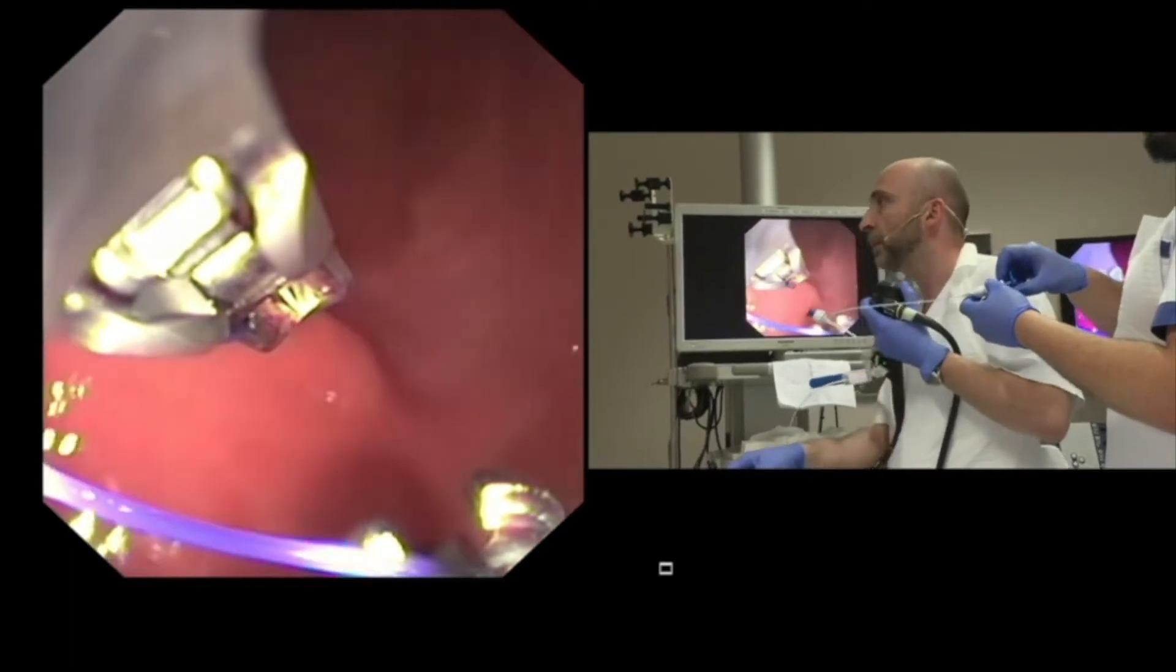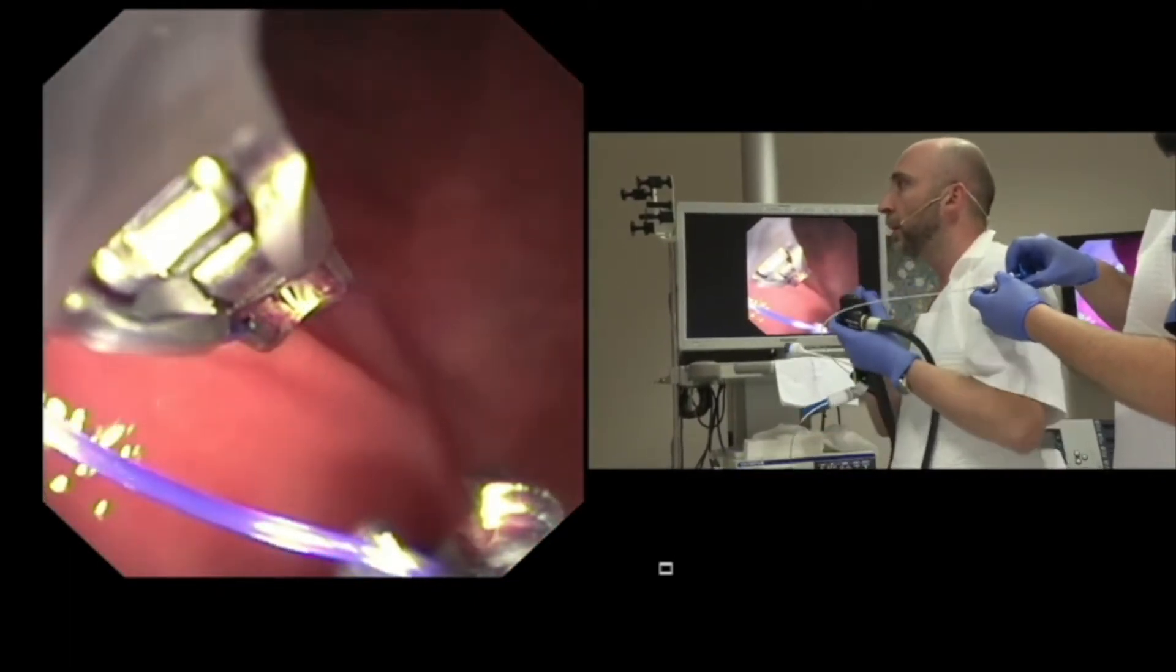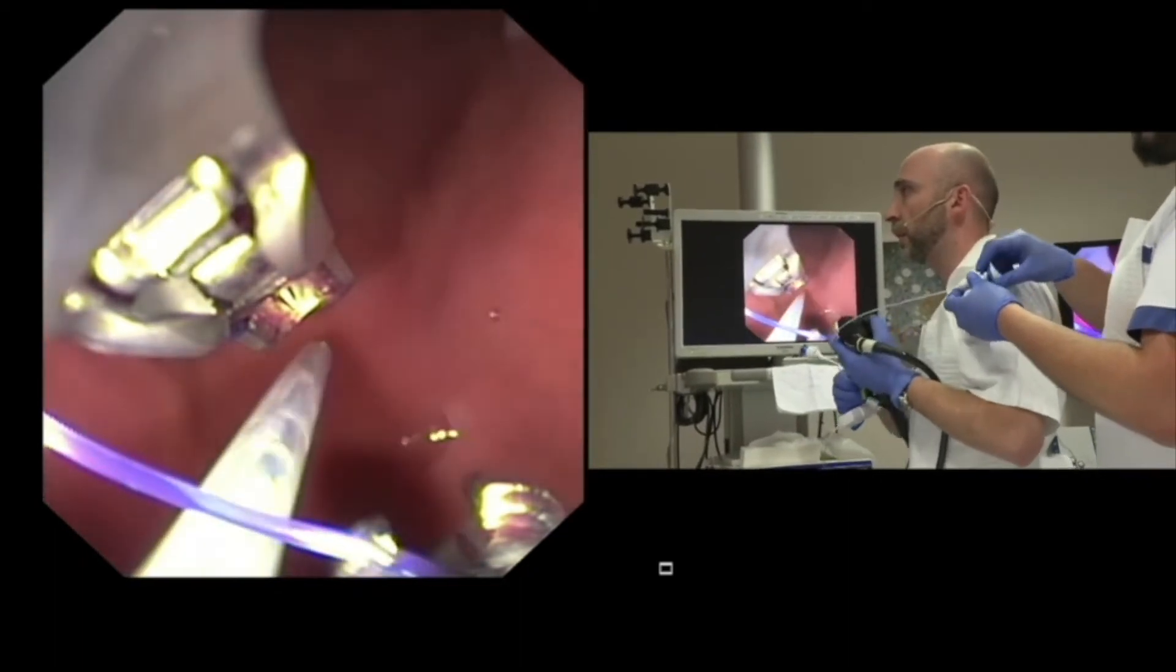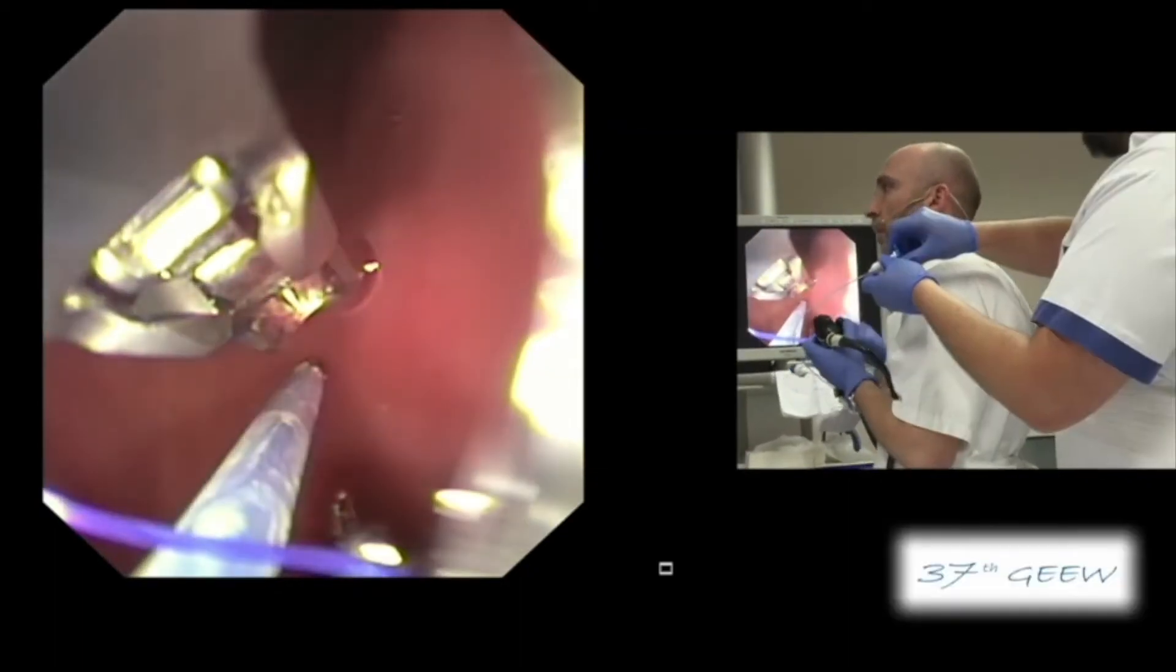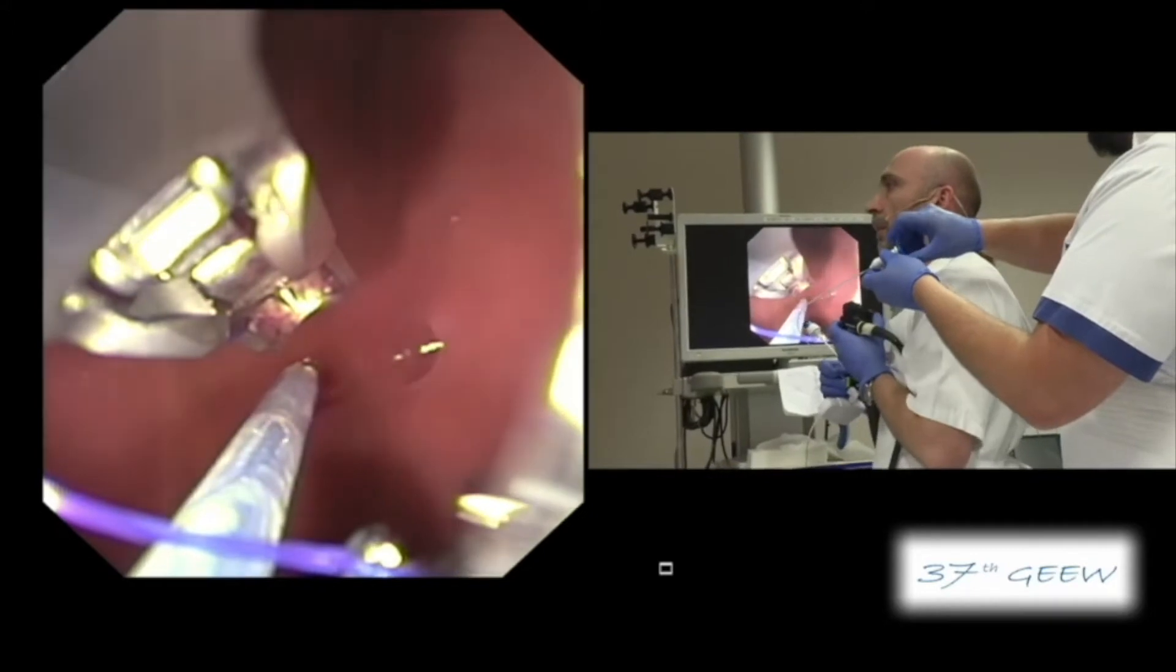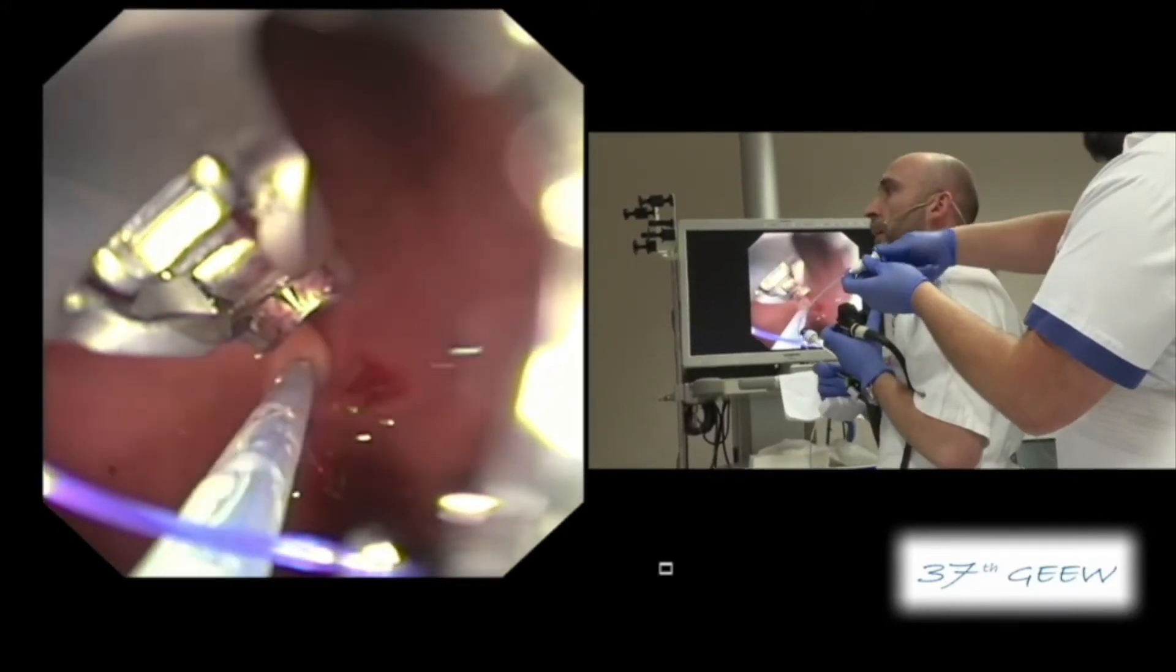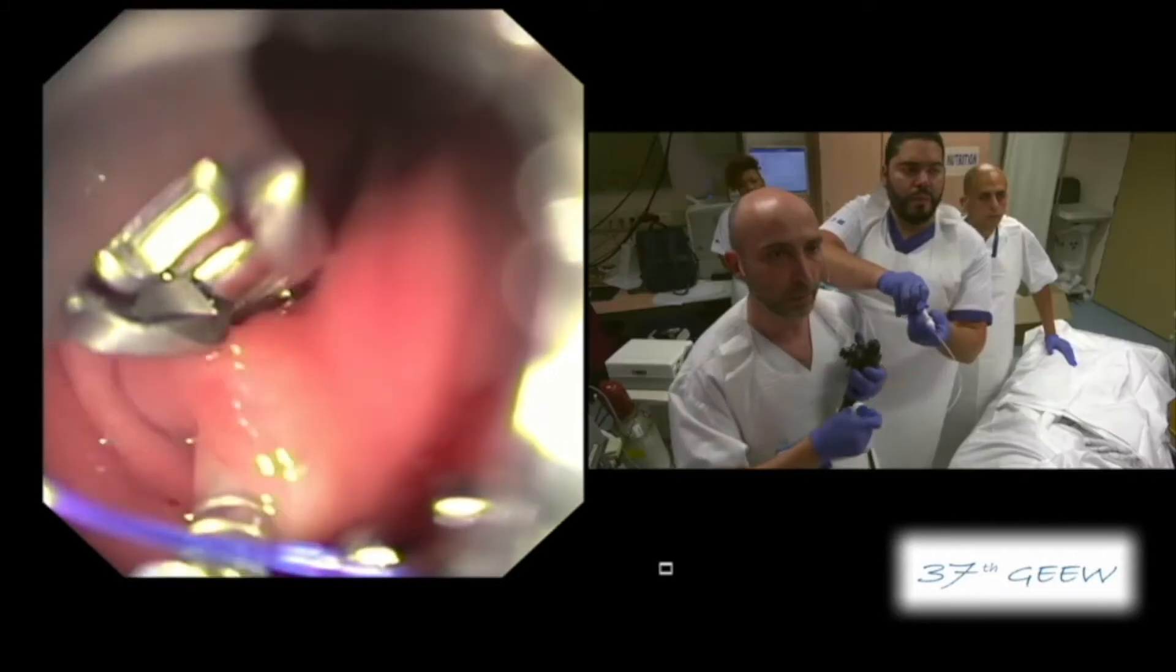Depends how big is the stomach. We can place from three to five to six rows of sutures. You can go here. One, two, three. And again.